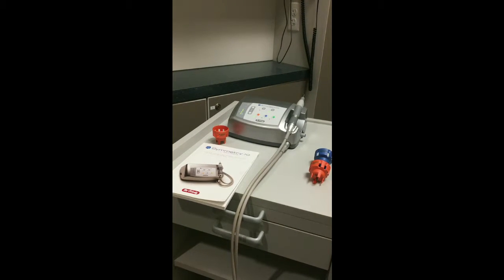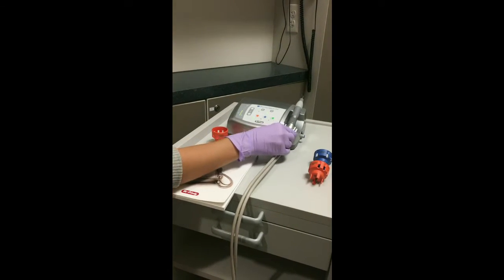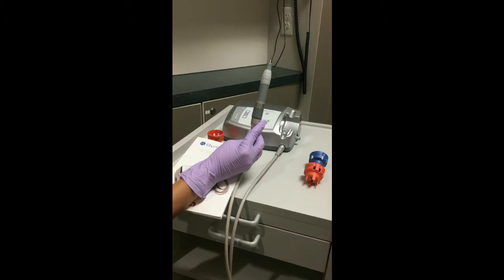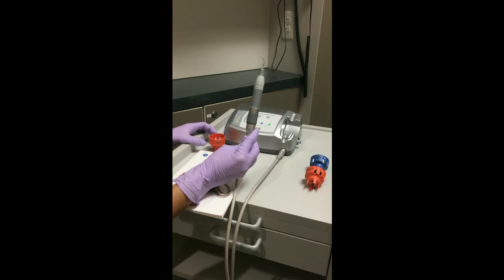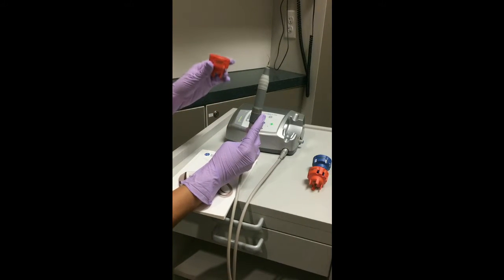The piezoelectric ultrasonic scaler is activated by dimensional changes in crystals housed within the handpiece. Each piezoelectric ultrasonic scaler has a ceramic rod located within the handpiece, and the tip is placed with a tip-specific wrench.